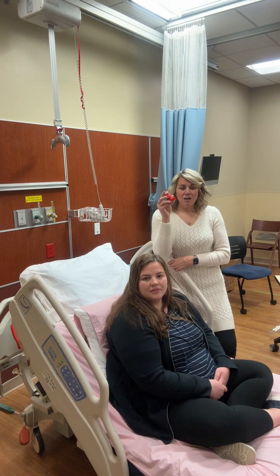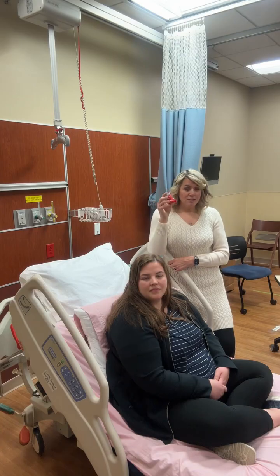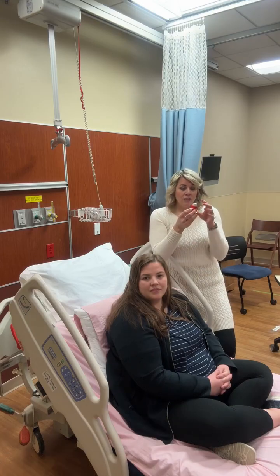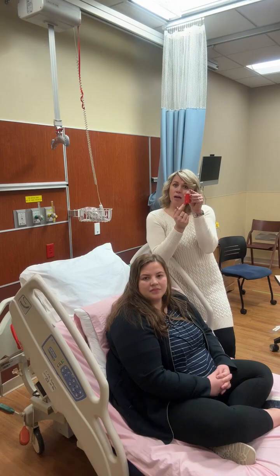When you're giving a patient education on an inhaler, and they're not going to use a spacer, which we'll go over in a second, make sure they know how many doses were originally ordered, because on the back is a counter.